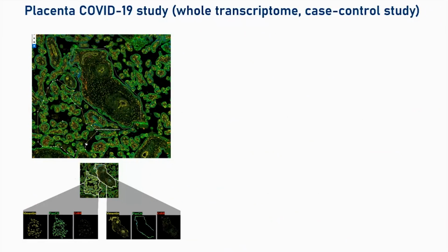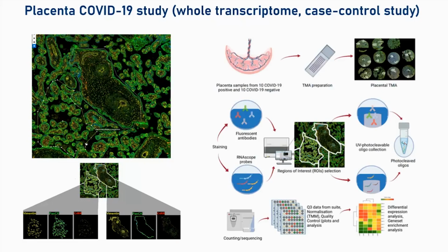And so we looked at age-matched placental tissues taken from COVID-19 patients and age-matched normal placental samples. And we went in looking at the multiple layers in the tissues.